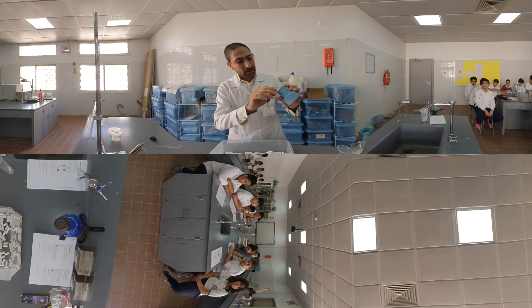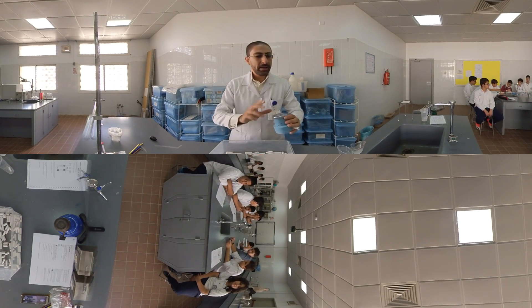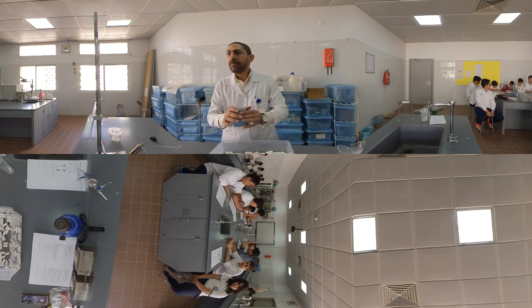The tidal volume reading is about 1,000. You can write it down. Now, moving on to the vital capacity.